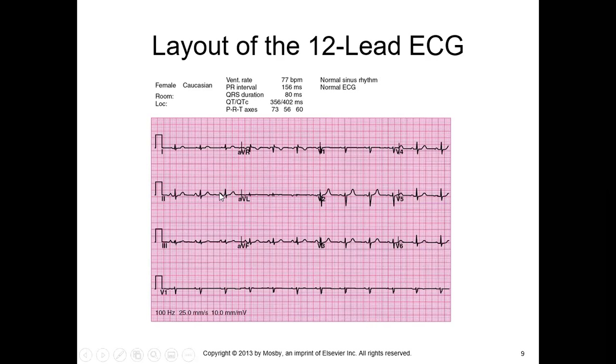All right, so the 12 lead EKG provides a 2.5-second view of each lead, because it is assumed that 2.5 seconds is long enough to capture at least one representative complex. However, a 2.5-second view is not long enough to properly assess the rate and the rhythm.